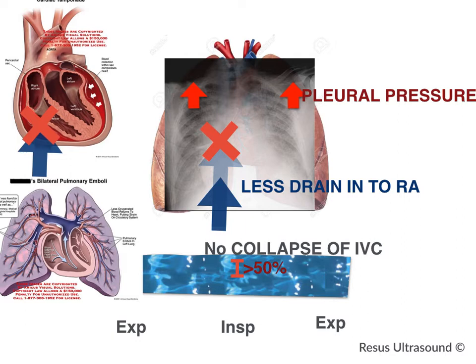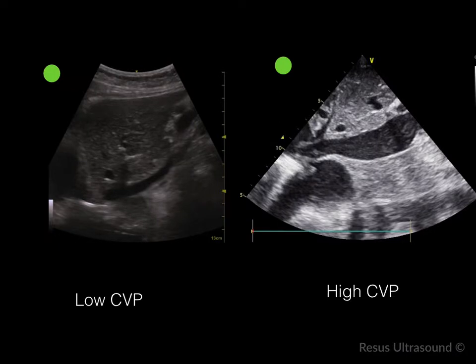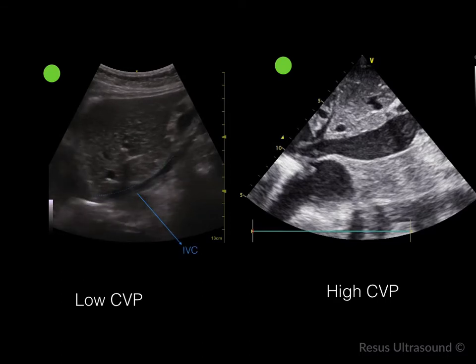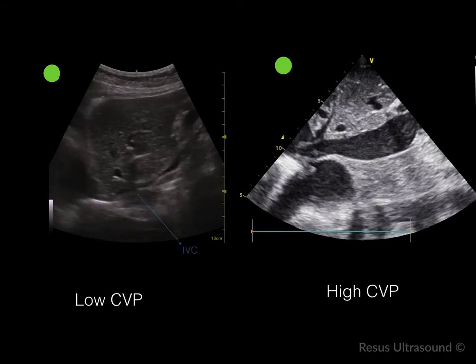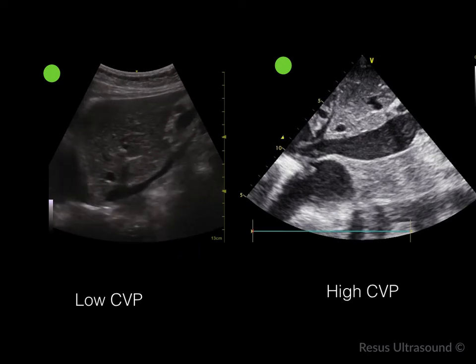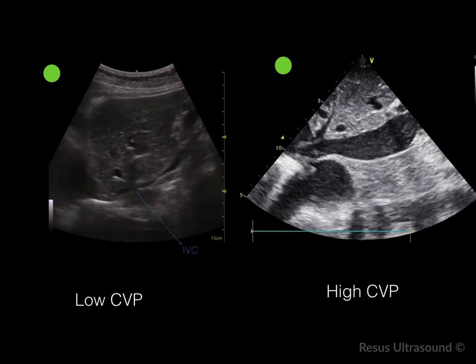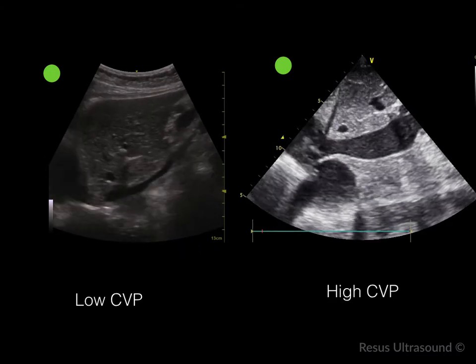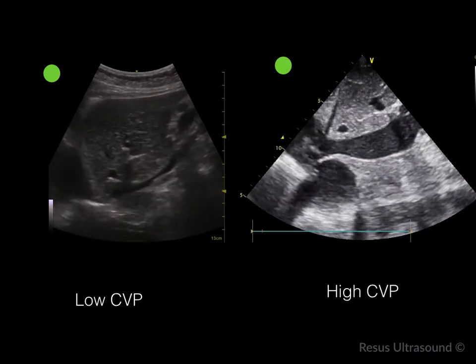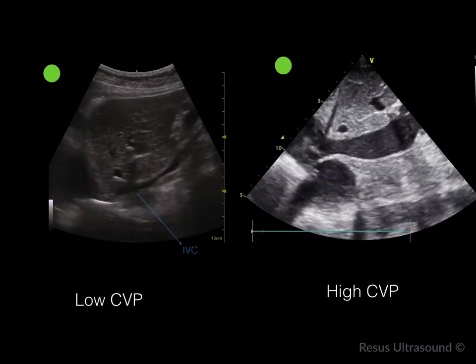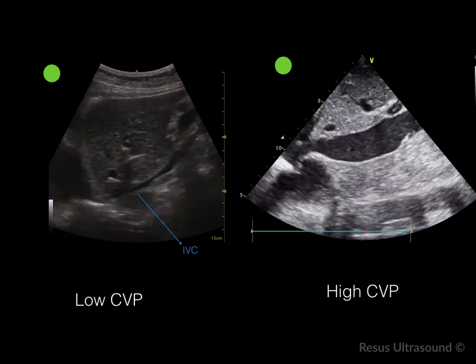Anything that prevents the IVC from draining into the RA — such as tension pneumothorax — would result in a rigid and non-collapsing IVC. Here are two easy 2D examples: the first shows the IVC — the Nike logo shape — is very thin and collapses when breathing in, meaning this patient should be volume responsive when presenting with shock or dyspnea. In the other patient on the right of the screen, the IVC is very large and doesn't collapse at all with inspiration or expiration.